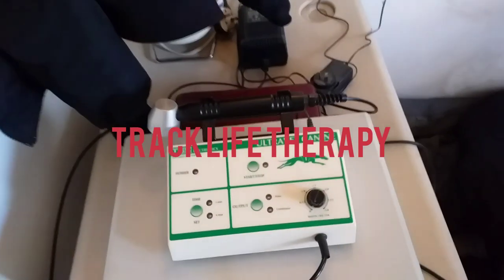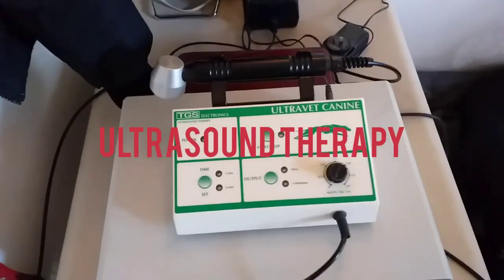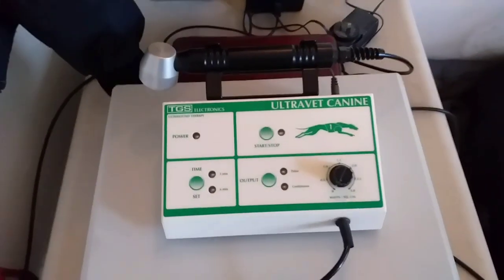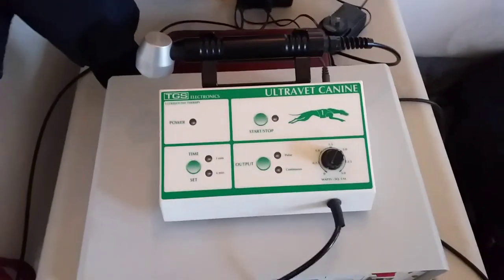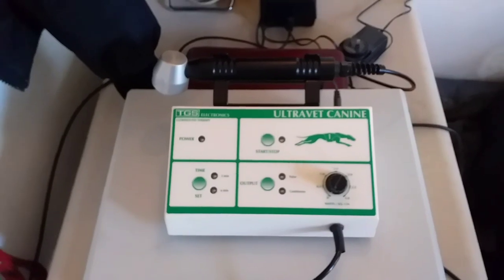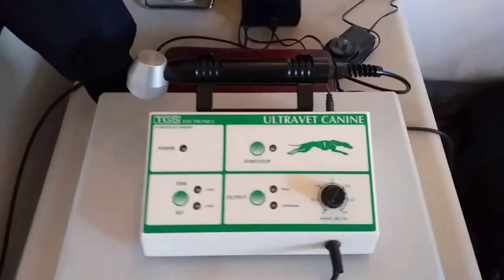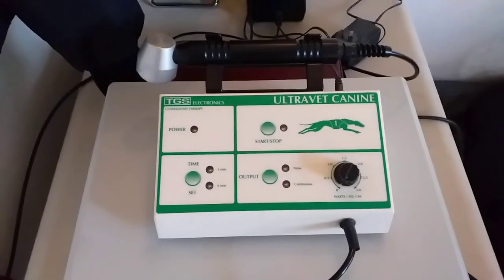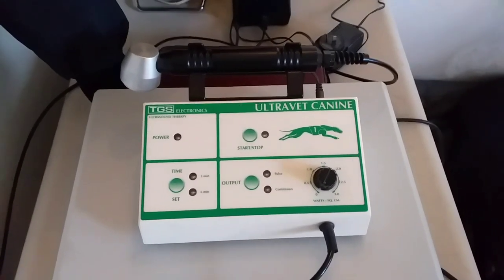Welcome to the next Track Life Therapy video. Today we're going to talk about ultrasound therapy, particularly the UltraVet Canine from TGS Electronics. This is a company from Australia and as far as I know they make the best greyhound-specific ultrasounds. You get ultrasounds for horses, you get them for humans, and the wattage per square centimeter on those differs wildly. So this is the safest and the best ultrasound you can use for a greyhound.